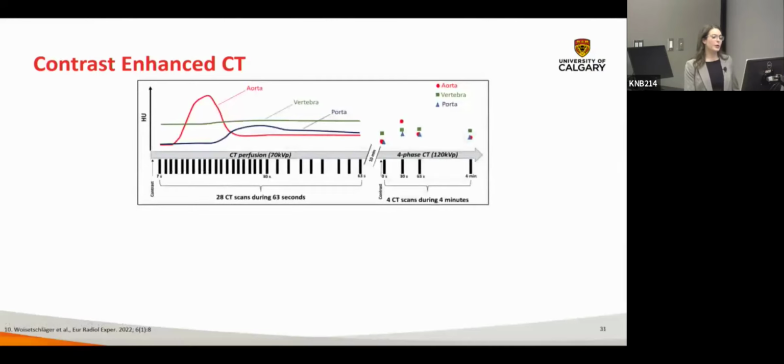Several studies have reported how contrast-enhanced abdominal CT scans can be used for BMD assessment by applying a linear conversion formula. So still applying internal calibration, but also applying a correction factor. However, there remains some discrepancy with a different study, which is demonstrating the variability of BMD depending on the scan time and the delay since the contrast injection. In this study, they used asynchronous calibration, and so they scanned the phantom monthly leading up to the study, as well as monthly throughout the study.